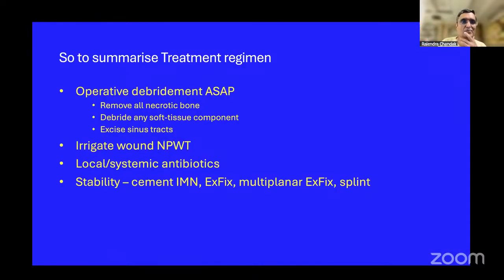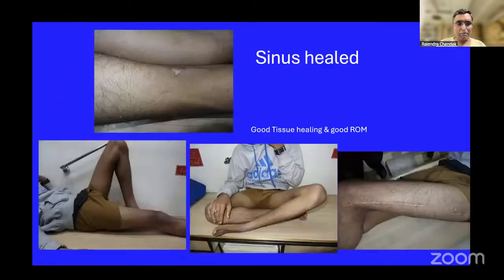Actually, what I like to take is this. This is how the patient healed. Sorry, I'll just stop share. So, the graft I like to take for all non-unions is from the inner table of the iliac crest. That is the inner table, one cortical side, and then cancellous pieces. The inner table we put onto the side of the bone at the fracture site, and then keep it in position with two small 3.5 mm screws. This is what my grafting procedure usually would be for a distal femur.